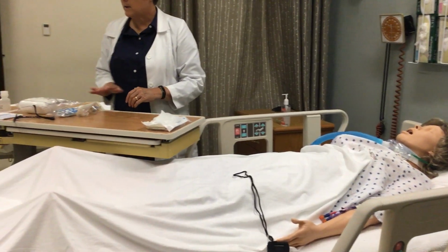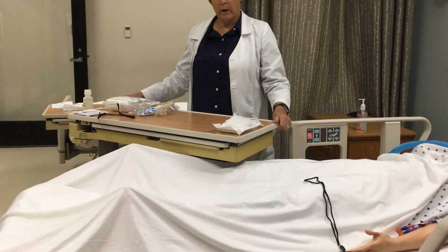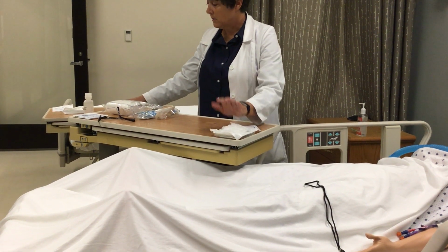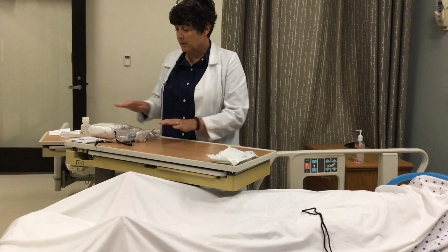Prepare the equipment on the bedside table. I've cleaned my bedside table. It's at a proper working height. Suction kit is prepared, and I have all my other items here as well.